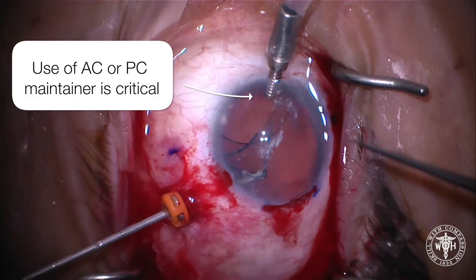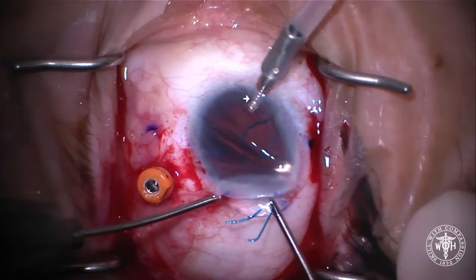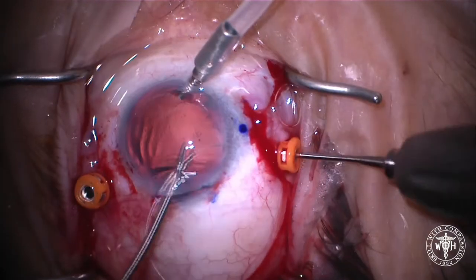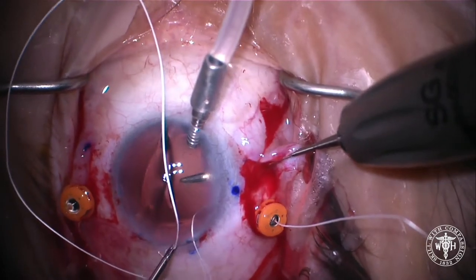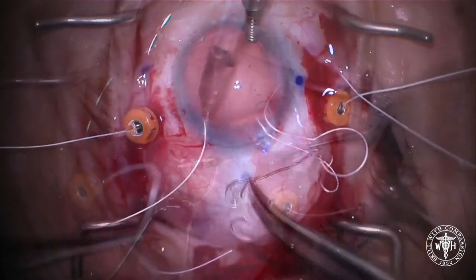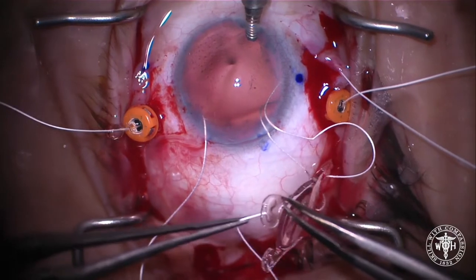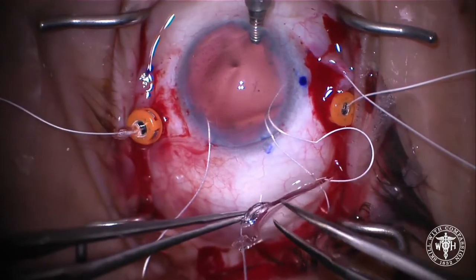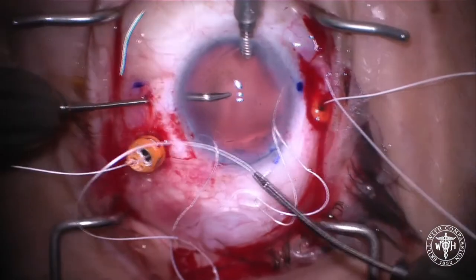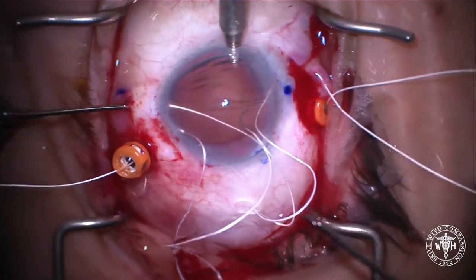Always do a vitrectomy before you remove the lens. Using an anterior or posterior chamber infusion system is critical in these cases. A single-piece PMMA lens is going out, and we're beginning the lacing of the hydrophilic acrylic IOL. The pattern for lacing this implant is important: we go down through one haptic, across to the other, and then up through the second haptic. This keeps the IOL further away from the iris and pushes the lens a little bit further back in the eye.